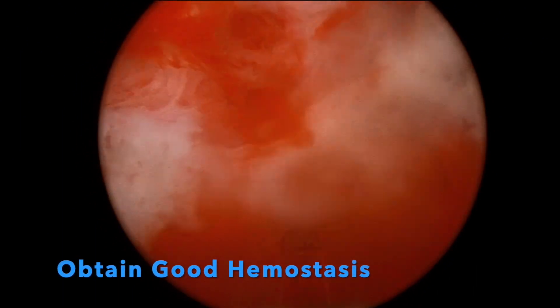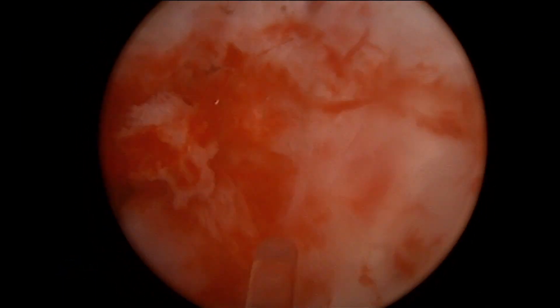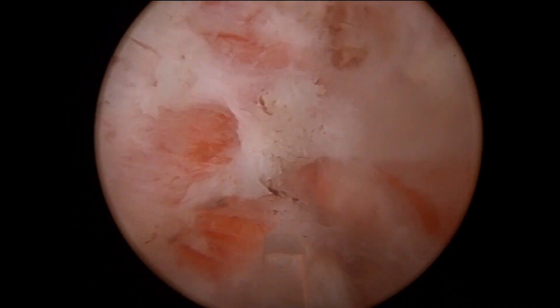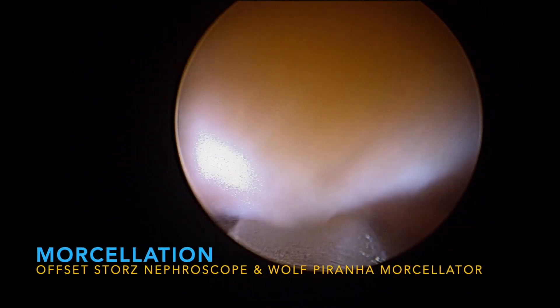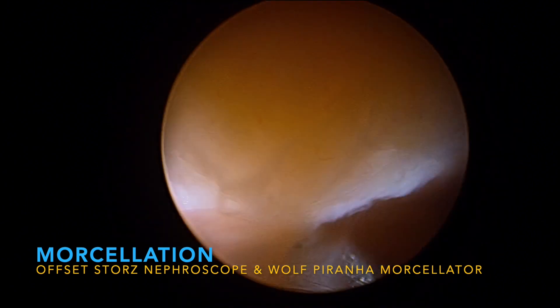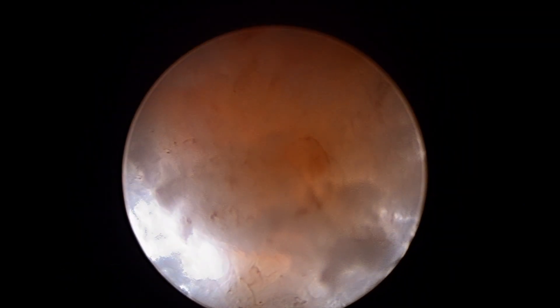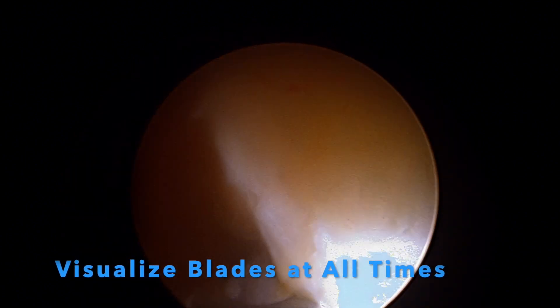Once the enucleation is completed, ensure good hemostasis is achieved as this will help with visualization during morcellation. Utilizing an offset stores nephroscope, a Wolf Piranha morcellator, and dual irrigation with three bags of saline flowing, morcellation is achieved. To engage the tissue, raise your hands to place the blade under the tissue and utilize suction, then drop your hands to lift the tissue from the base of the bladder. During morcellation, you should have clear visualization of the blades at all times and distention of the bladder in order to decrease risks of injury.